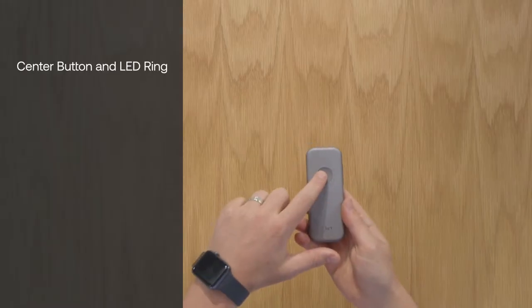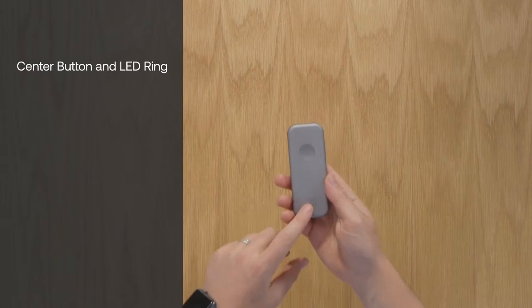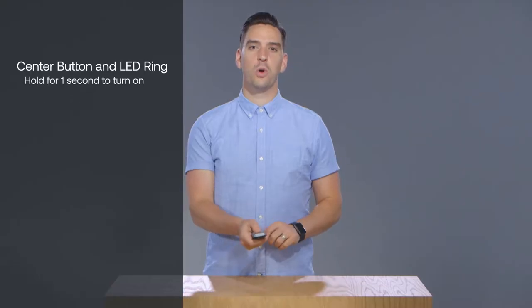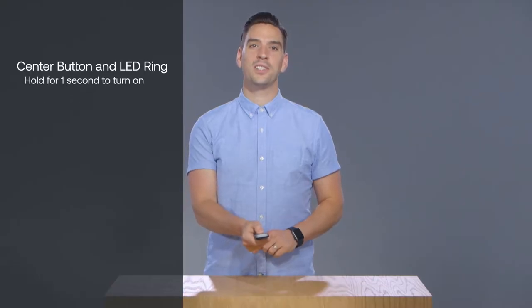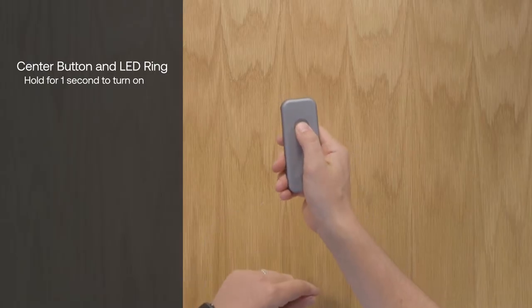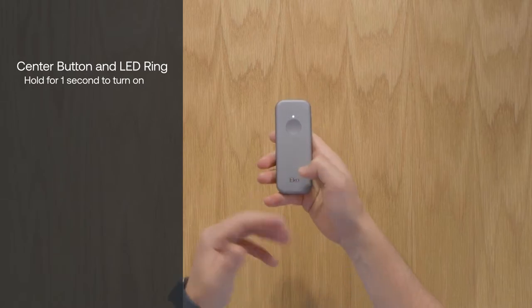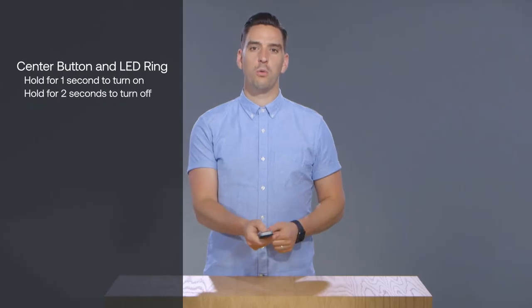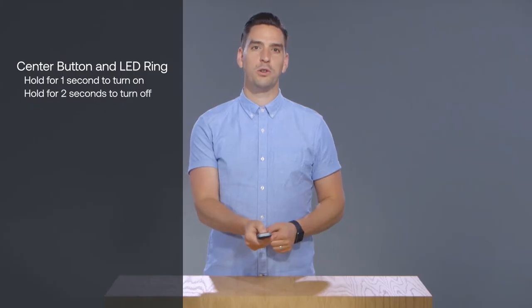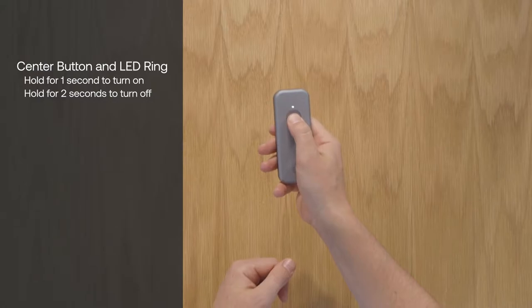First on the silver side is the center button surrounded by the LED ring. Turn on your Duo by holding down the center button for one second. The LED ring will light up. Turn off your Duo by holding down the center button for two seconds. The LED ring will power down.